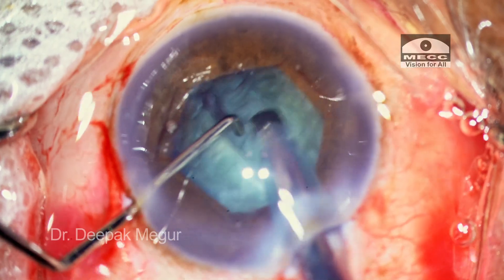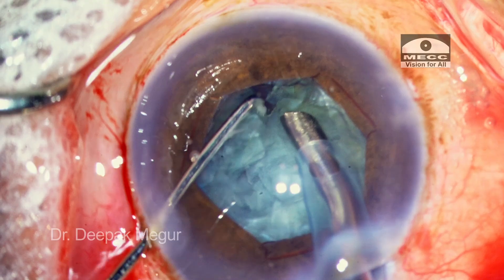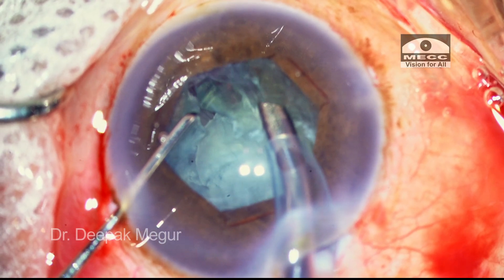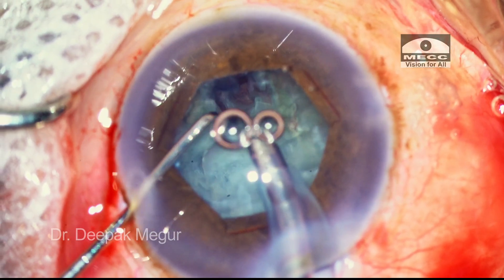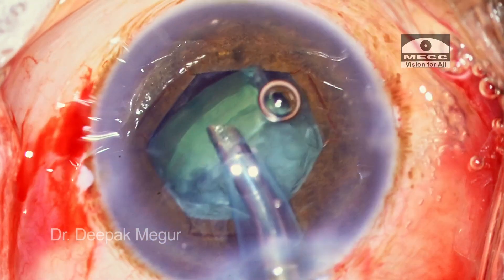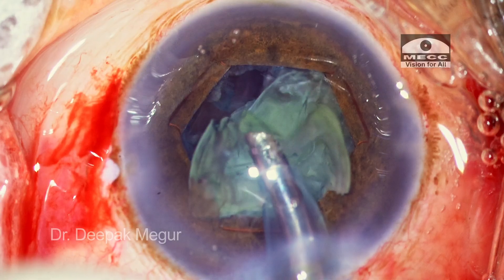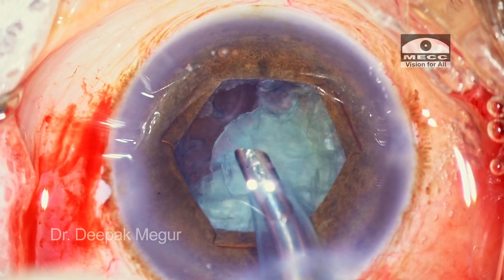The nucleus is broken into two halves. Now she's going to divide each heminucleus into smaller fragments. At this time she notices that the patient is slightly uncomfortable — he's telling her he's going to cough. Nevertheless, the first heminucleus is emulsified.